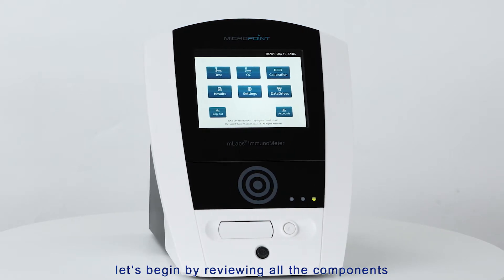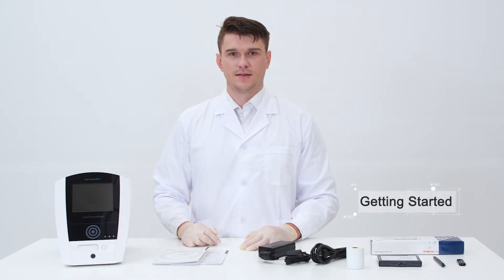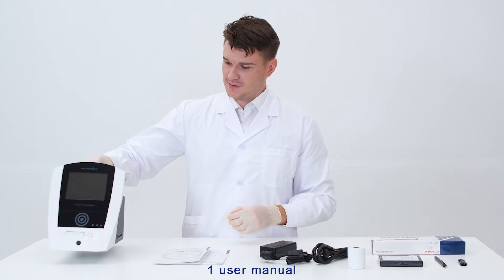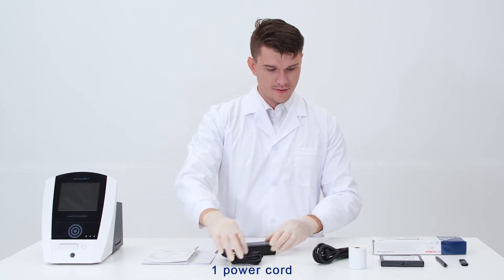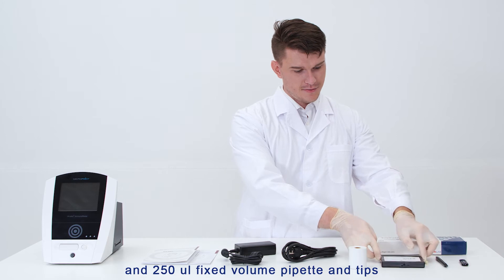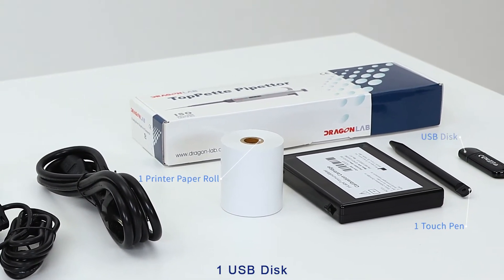Let's begin by reviewing all the components that make up the M-Labs Immunometer. Before we begin, ensure you have the following materials: one M-Labs Immunometer, one user manual, one quick start guide, one power cord, one power adapter, one calibration cartridge, one 250 microliters fixed volume pipette and tips, one printer paper roll, one touch pen, and one USB disk.